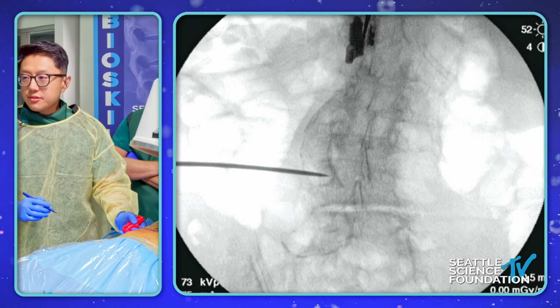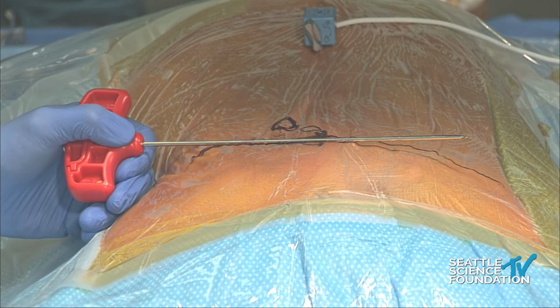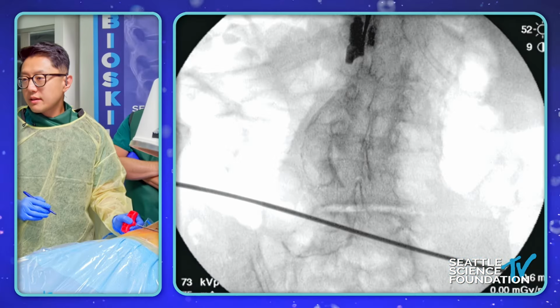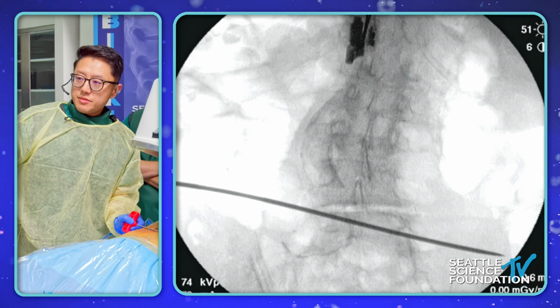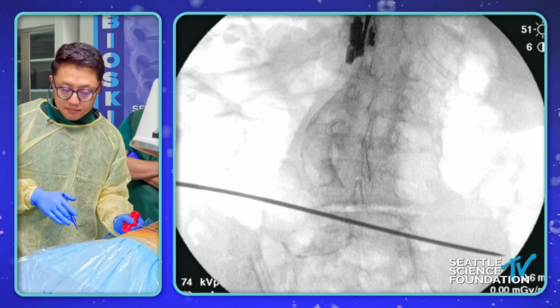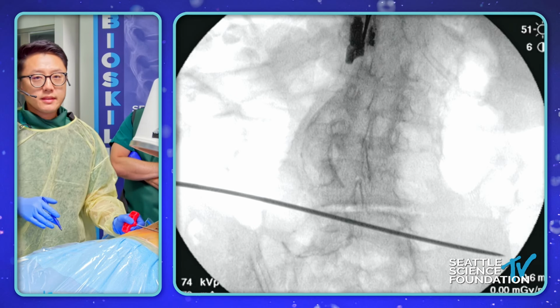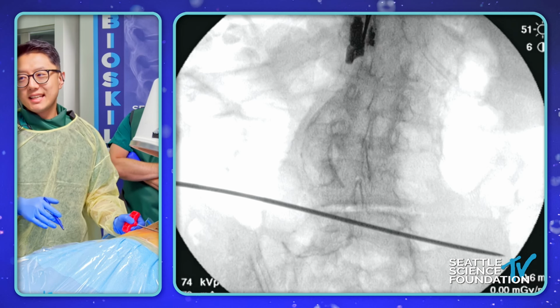So if we draw a standard trajectory on this, let's take a shot there. So one more shot there. So you can see that basically I'm hugging the ipsilateral top of the pedicle. So Meng, another question is here right now. A lot of people are wondering what angulation you take there, and I've had hours and hours of discussions with other surgeons, how many degrees and how to get that inclination. So what is the solution to this, Meng?